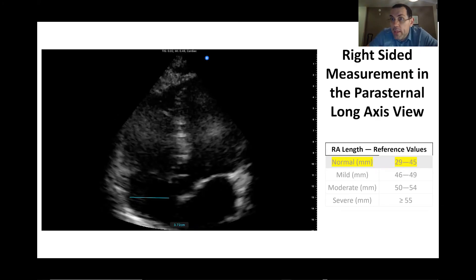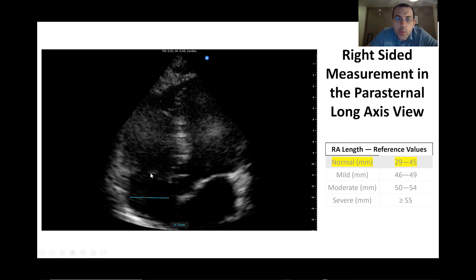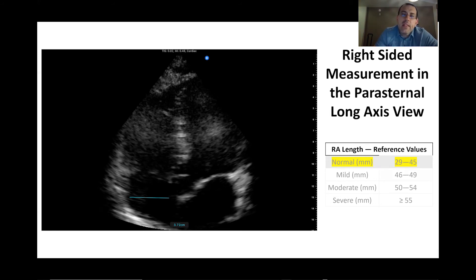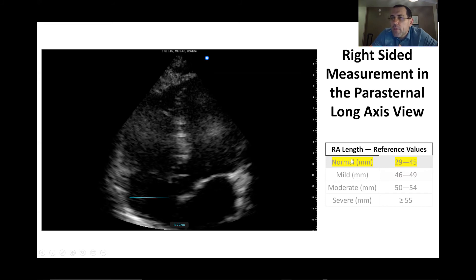For the right atrium, very similar to the left atrium, we expect a symmetrical shape — one-third by one-third horizontally and vertically — and a size less than 4 centimeters. Here I show 3.72 centimeters. These values are a little more specific, but remembering that it's roughly one-to-one with the left atrium makes it easier to recall.